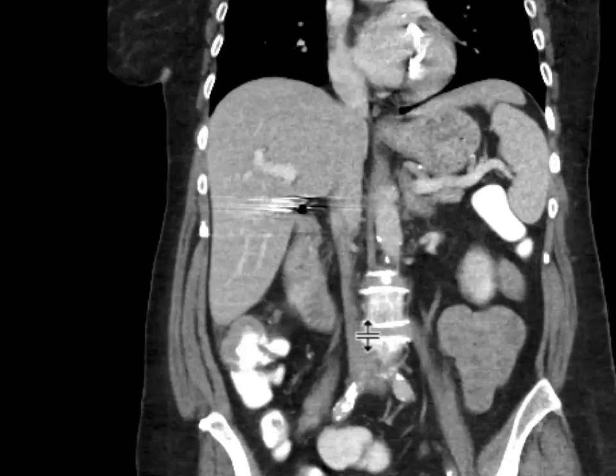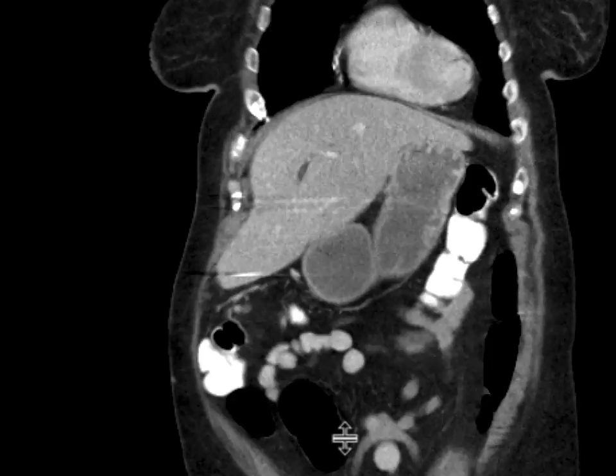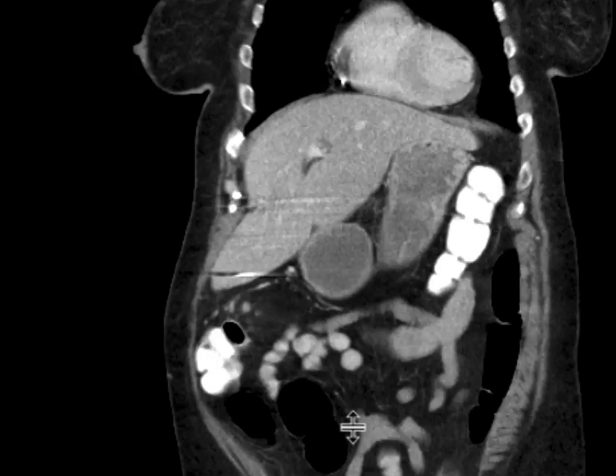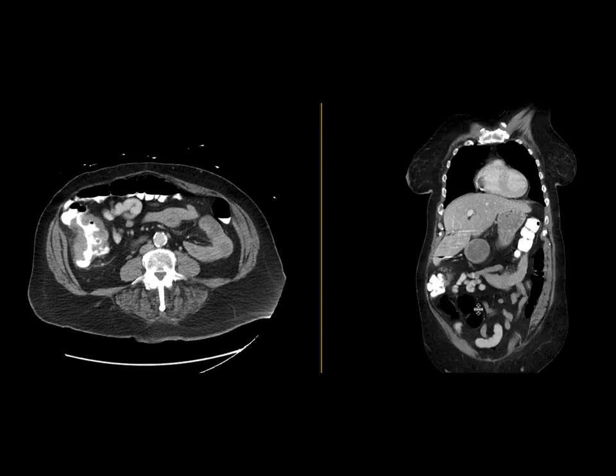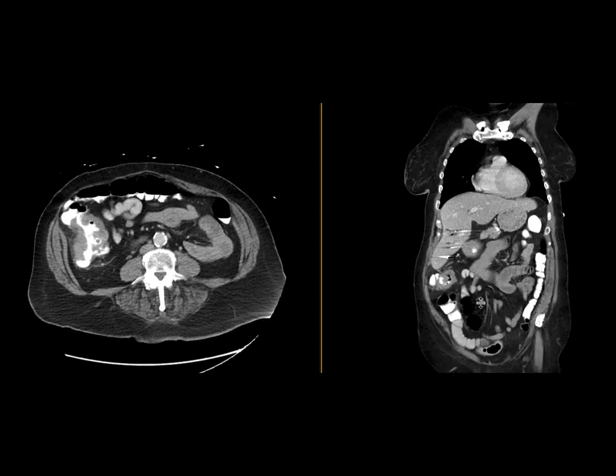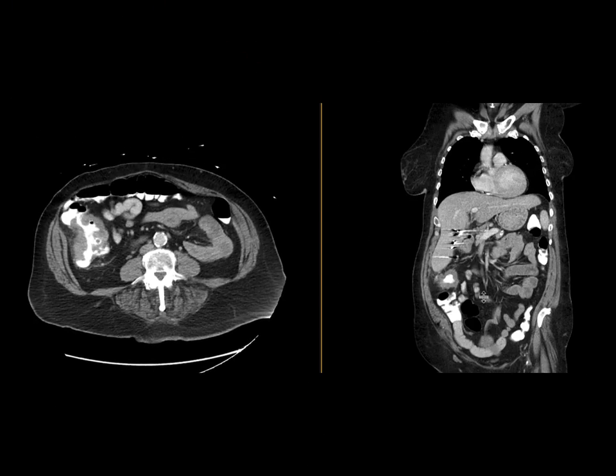So this was on imaging very concerning for an ascending colon neoplasm. This was biopsied. This is what it turned out to be on colonoscopy.